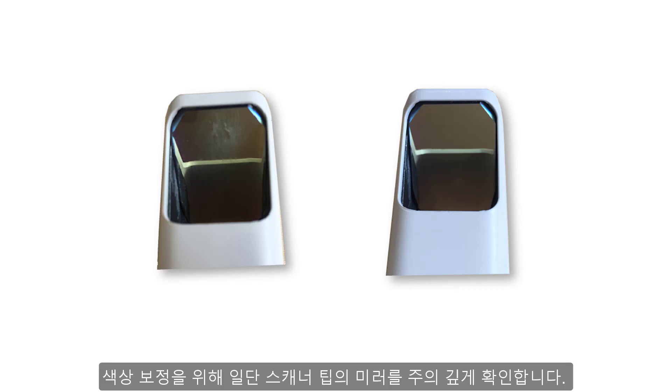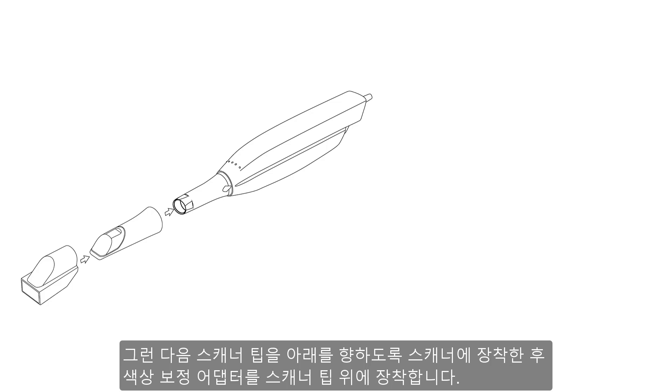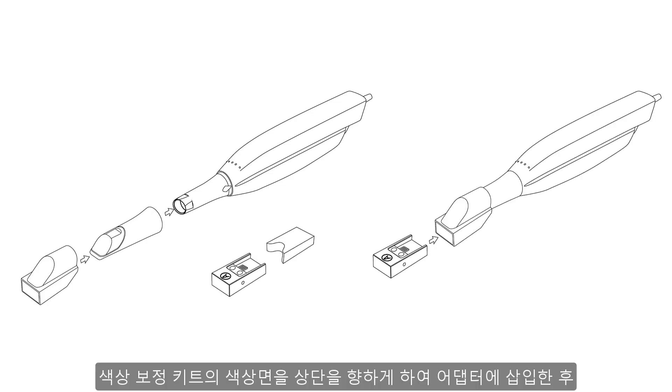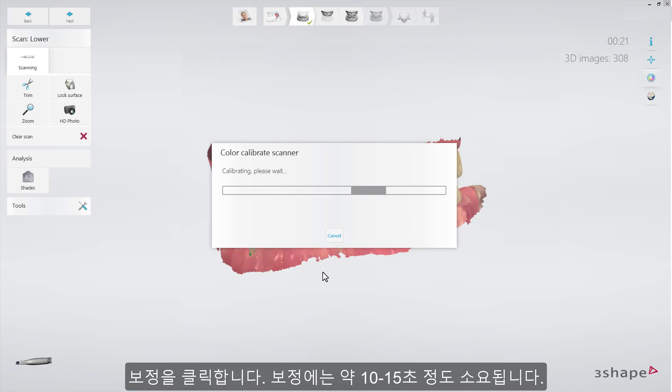First, carefully examine the mirror of the scanning tip. The mirror must be cleaned and sterilized, free of scratches, water stains, and dirt. Afterwards, attach the tip to the scanner facing downwards and put the color calibration adapter onto the scanner tip. Insert the color calibration target into the adapter with the color side facing up, and click Calibrate. It will take only up to 10 to 15 seconds.